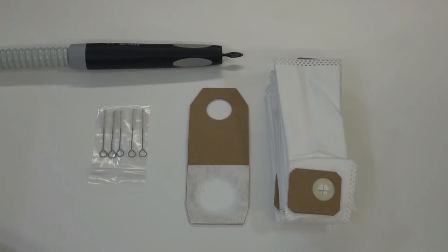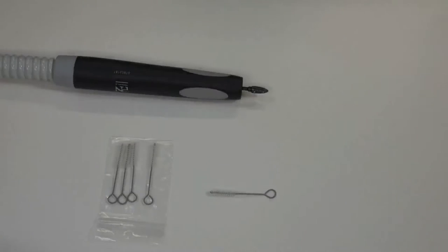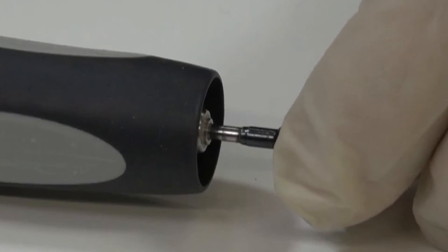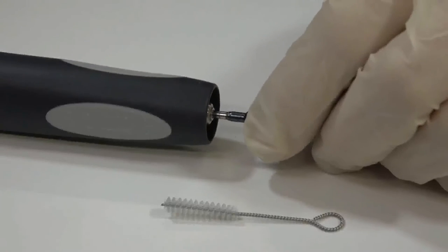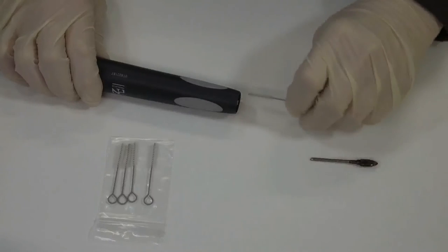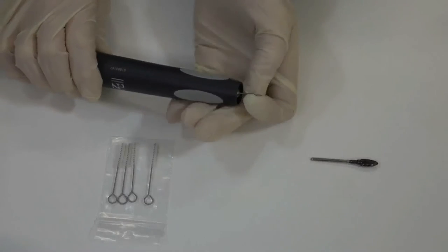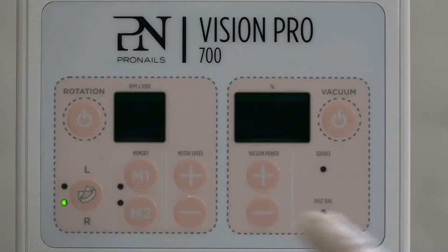Turn the device on standby. Remove the bit or milling tool. Carefully insert the brush as far as possible. Hold the brush firmly and briefly press the rotation key.